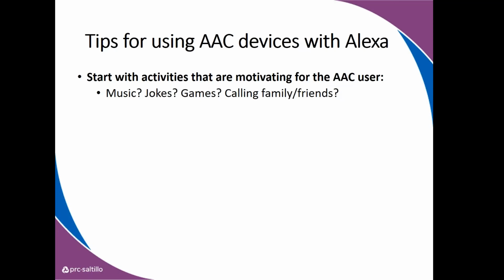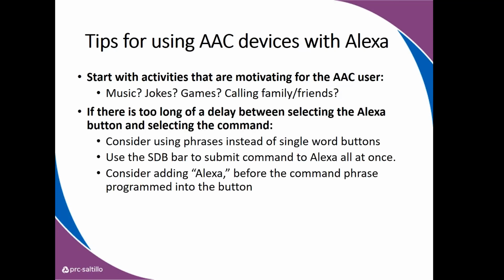Other little tips and tricks: if there's too long of a delay between selecting the Alexa button and the command, so you saw that I would click on a button that says Alexa, and then click on the phrase, the command that I wanted Alexa to do in that video I shared, right? You could use those phrases to make it quicker to respond. You could also use that speech display bar. On most AAC devices, once you put things in your speech display, you can activate that and submit the command all at once.